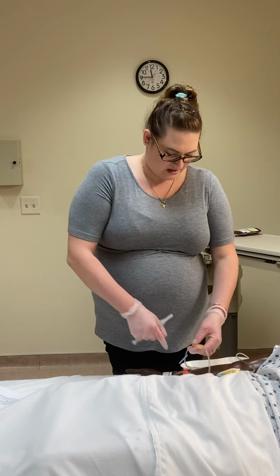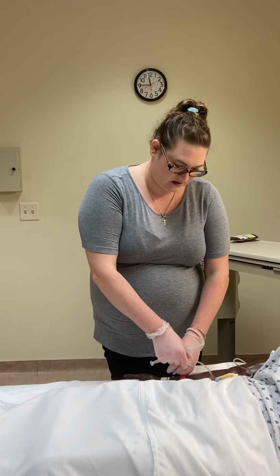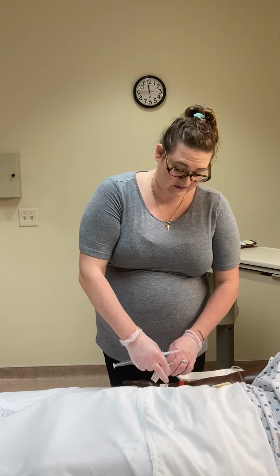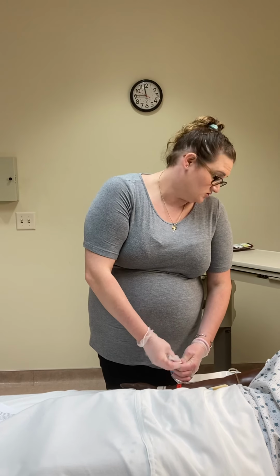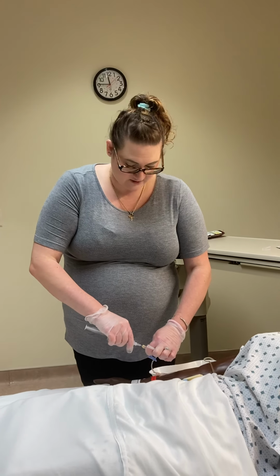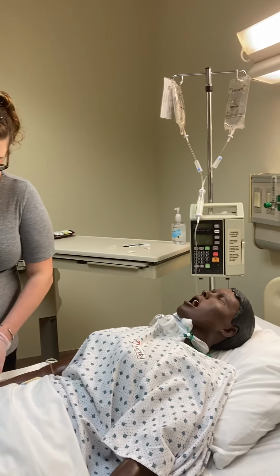And so what I'm doing now is I'm going to disconnect, because I stopped it. I'm going to flush and disconnect. If I don't already have a spare saline in a new primary line at the bedside, I am going to request somebody to bring it in for me: a 1 liter bag of saline and a primary tubing stat. I'm going to get that new line up and running as soon as it arrives, or if I have it at the bedside, I get it up and running. All of the blood tubing is going to go back to the blood bank.